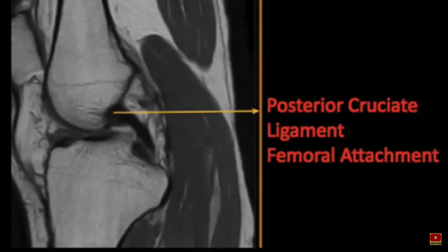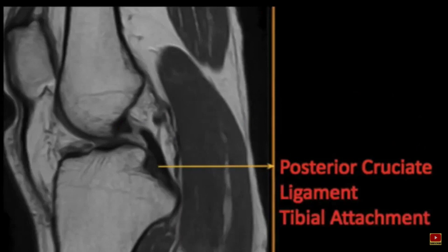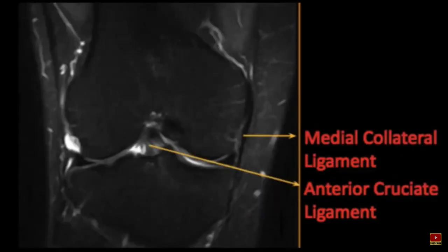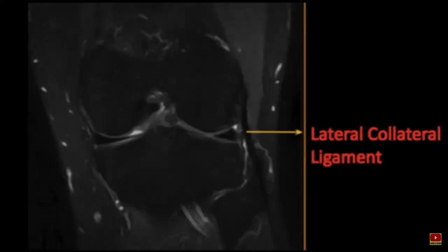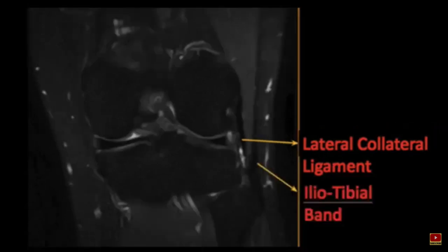Next we come to the posterior cruciate ligament. It has a femoral and tibial attachment which may not be seen in the same plane — this is normal. After that, I see the medial collateral ligament: its continuity, signal changes, and surrounding structures, looking for edema. For the MCL, we assess the superficial and deep fibers. Then we come to the lateral collateral ligament, which is usually not seen in one single plane unless it is redundant or pathology is suspected.